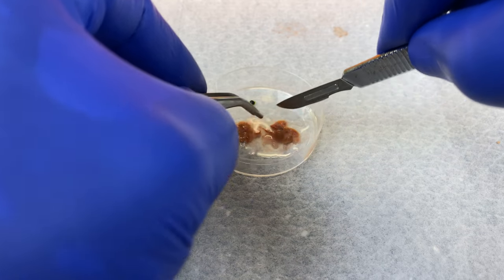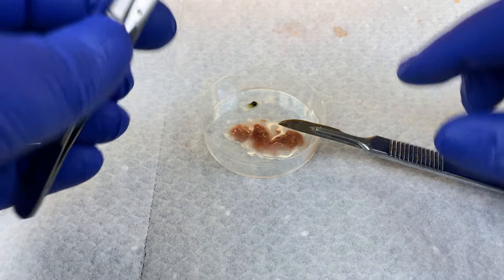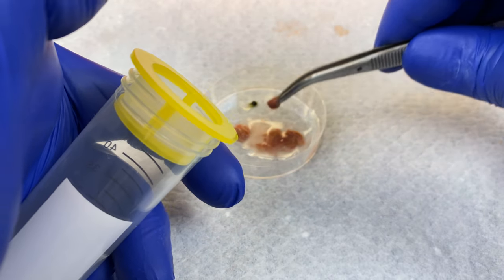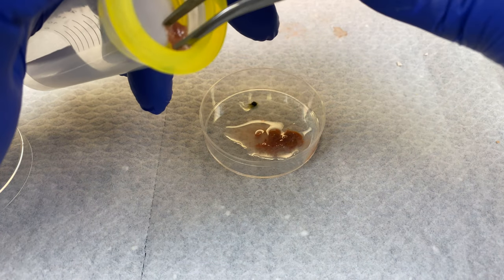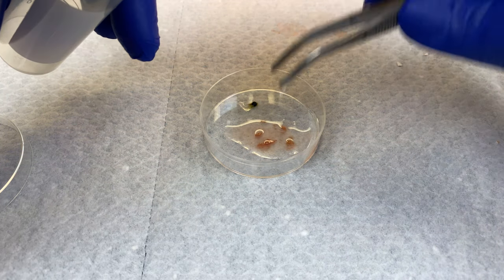We will cut up our tissue with sterile forceps and a scalpel blade. Remember, when switching between tissues, make sure you sterilize — this is extremely important so we do not get cross-contamination, such as mixing our heart cells in with our liver cells. We will transfer the entire cut-up organ into the cell strainer.